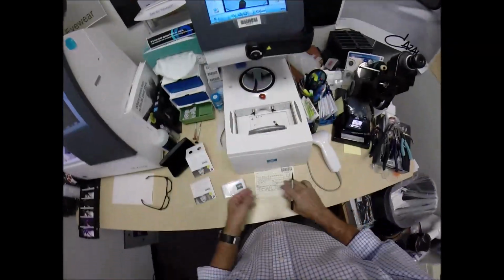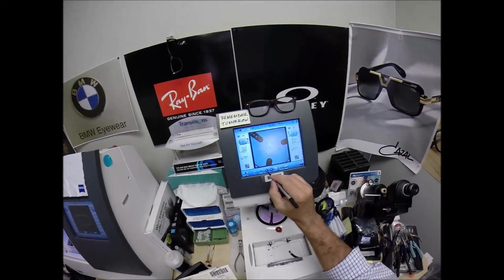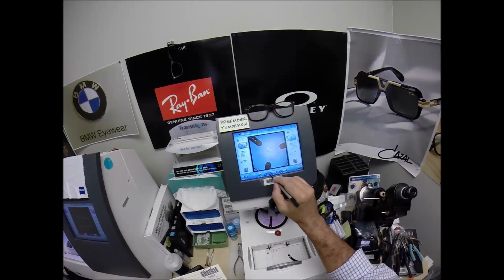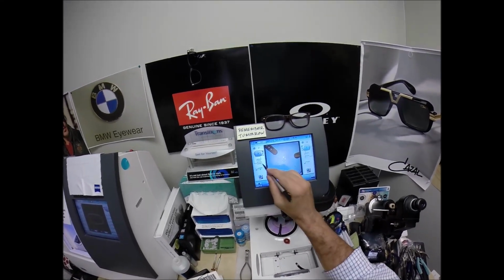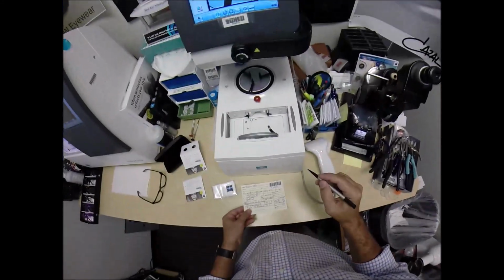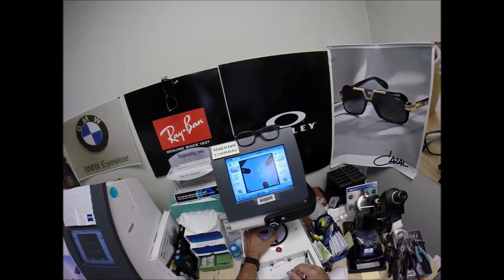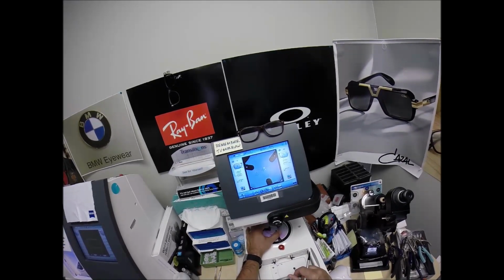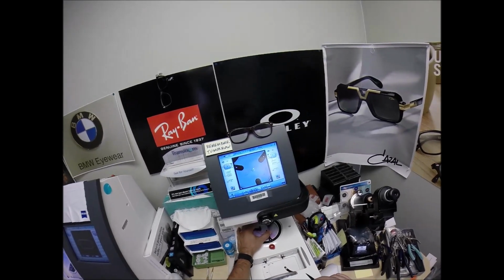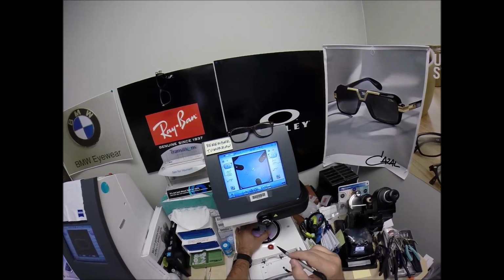Now I need to enter my pupillary distance, which is 31 for the right eye. The computer starts at 32.5, so I'm going to tap the minus button until we get to 31. I want to raise the optical center height, the seg height, to 24. Change the layout screen from single vision to progressive. Now I can lay out my lens. Make sure that it's oriented in there just perfectly. Okay. Always like to check to make sure the lens is large enough, and it is.